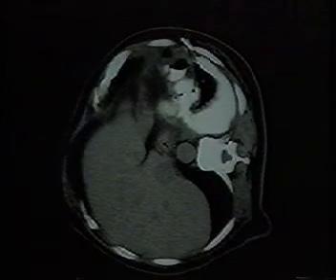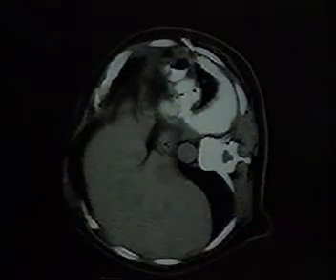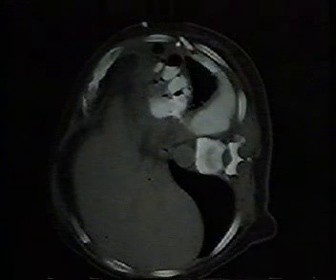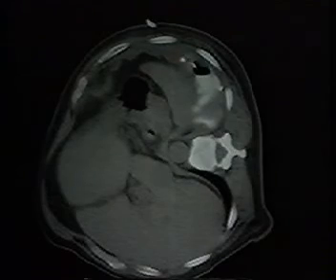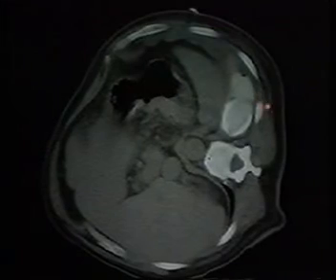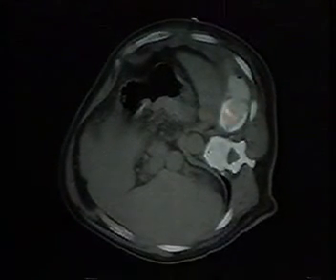In order to try to drain the posterior collection more adequately, because we were concerned that the position of this pigtail tip was perhaps not in the most dependent part of that pleural fluid collection, and that the adhesions or the apposition of both visceral and parietal pleura might preclude adequate drainage of the more posterior locule here, we decided, while on the CT table, to place a guide wire through the catheter and then put the guide wire into the more dependent locule posteriorly. Here you see the guide wire in the very deep portion of the costophrenic sulcus, and then simply slid a larger new catheter into the more dependent fluid collection posteriorly.